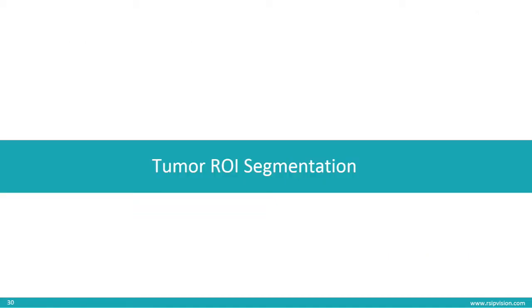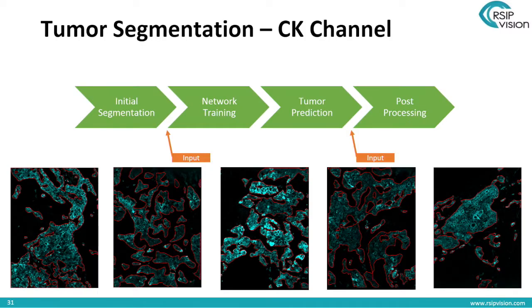This is another comparison. Okay. I'll go on to the next test. This is tumor region of interest segmentation. So now we're looking for regions of the image, which are suspected tumor regions or some other region of interest. So it's a very different task in the sense that you're not looking for individual blobs in an image.